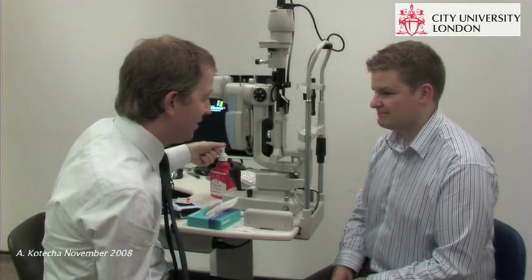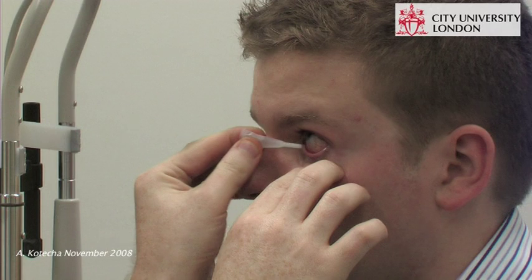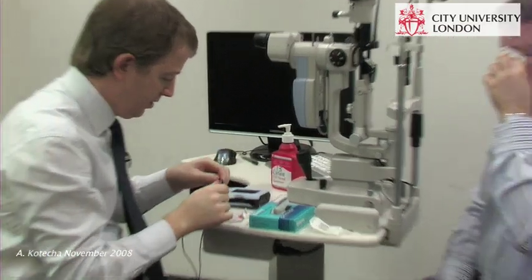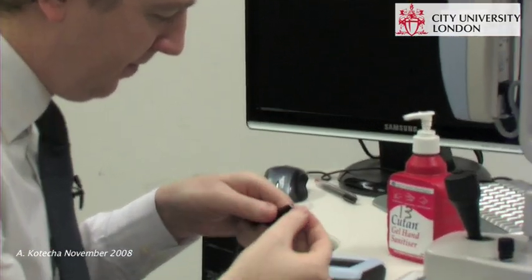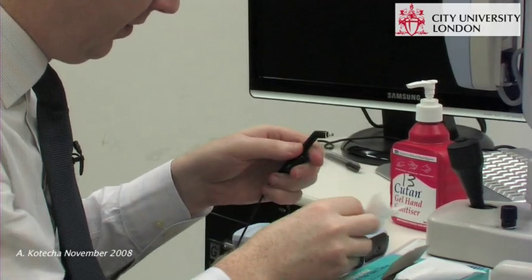Hello, I'd just like to check the thickness of your cornea, starting by putting a drop in which will numb the front of the eye. So if you could just look up, it may sting a little. And here's the tissue. If you could just hold it there in the corner. Well done. And I'm going to clean the pachymeter tip using an alcohol swab. Normally I'd let it air dry, but I'm going to use a tissue to make it a little faster.